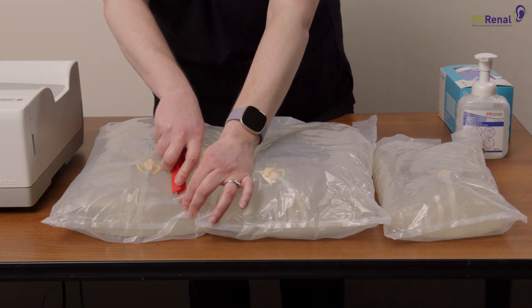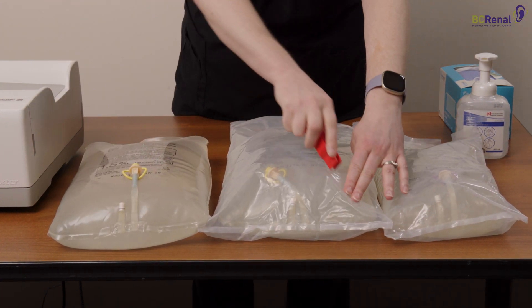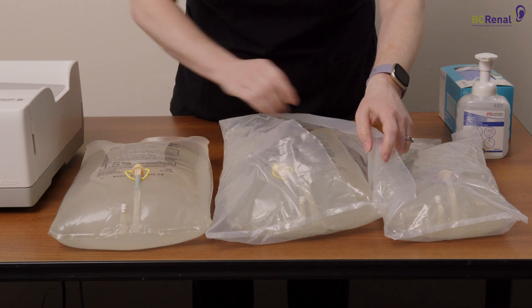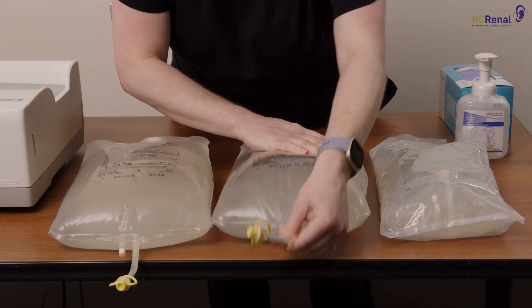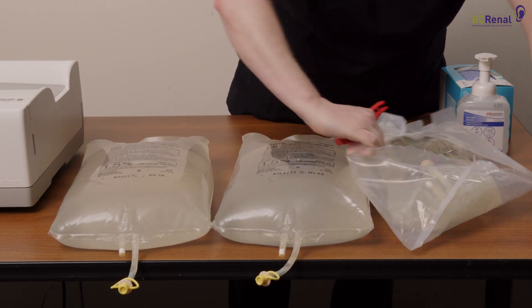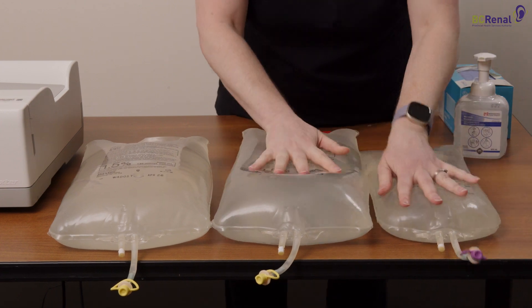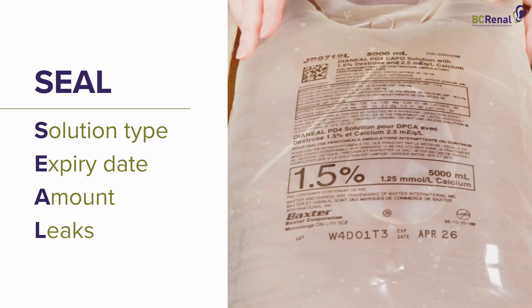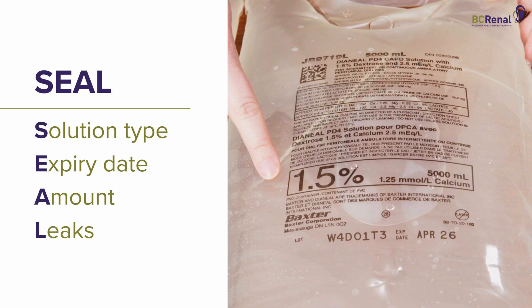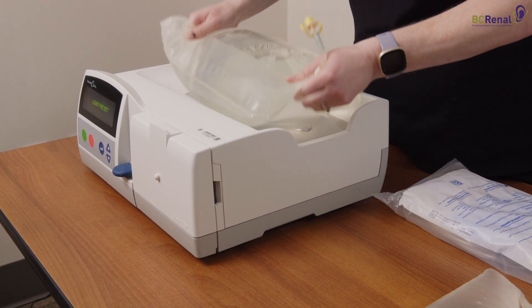Open all of the dialysis solution bags on your workspace. Examine the solutions using the word SEAL: check the solution type, the expiry date, the solution amount, and if there are any leaks. Make sure the solution is clear. Place one 5-liter bag on the heater and all other bags beside the Cycler.